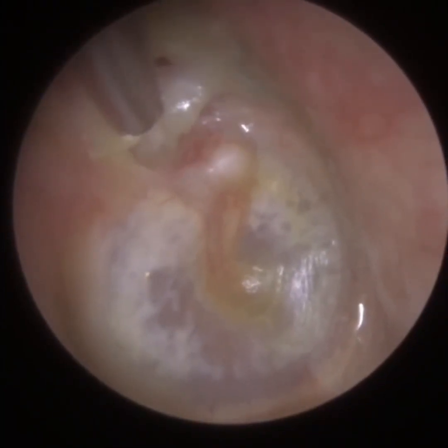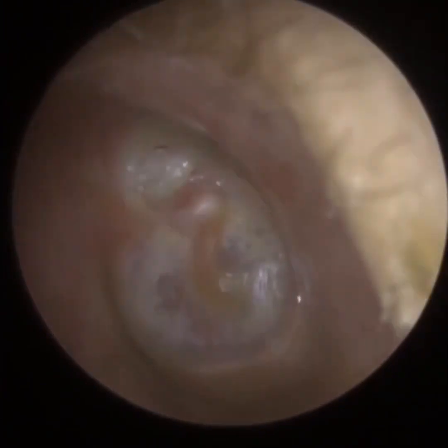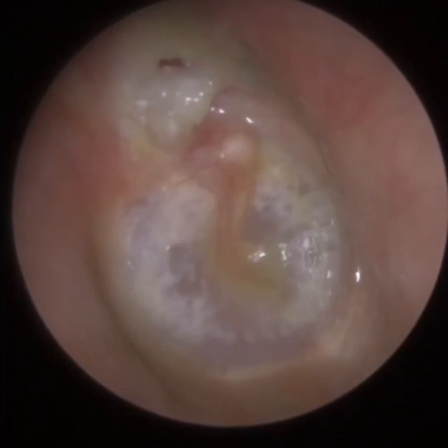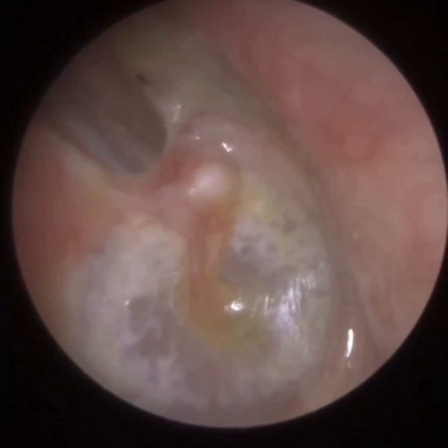The patient has obviously experienced a lot of discomfort prior to attending, so I'm just being really, really gentle here. I'm using a fine-gauge end, because my suspicion is that the patient has a cholesteatoma hiding behind this wet, dead keratin that I'm trying to gently suction — and it was a bit crusty as well.